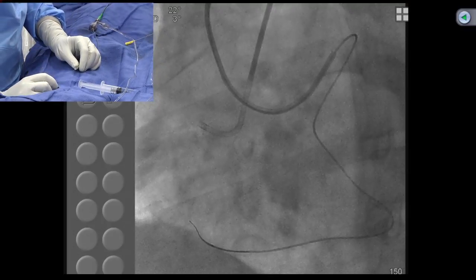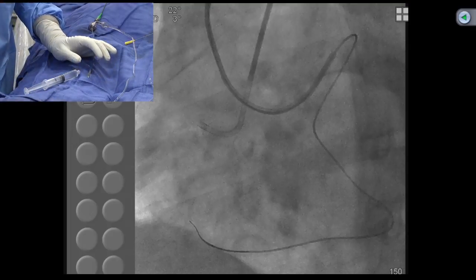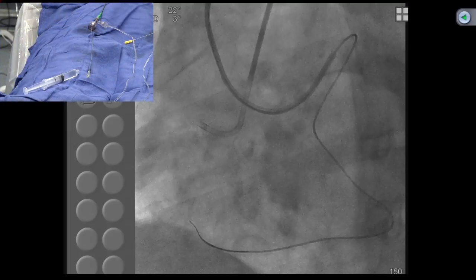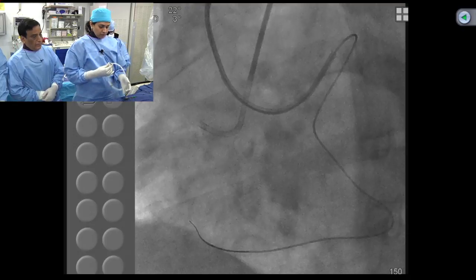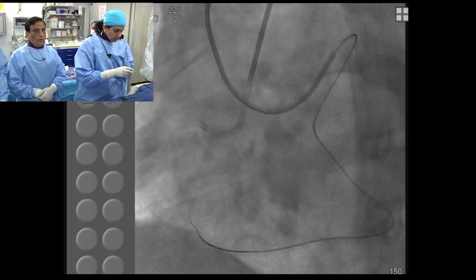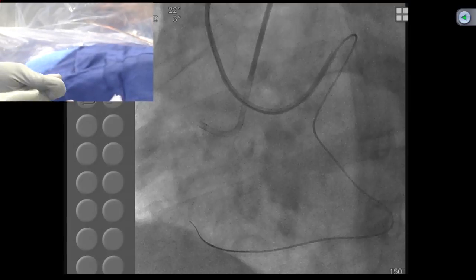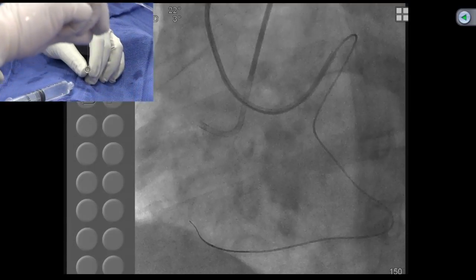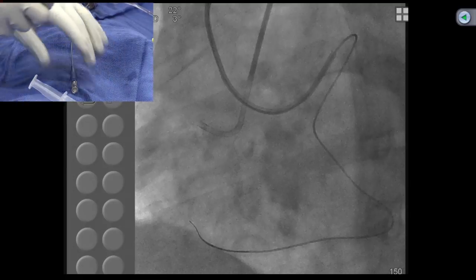Actually, the Japanese have written a paper on this issue, that if there is a very large plaque burden, in those cases, based on the CT, do not do a recanalization of the CTO, particularly retrograde, because it will be associated with tremendous myocardial infarction, slow flow, and so on. So that is incorporated. We are not using that routinely, but this is something to keep in mind, particularly if you don't see the course of your vessel.